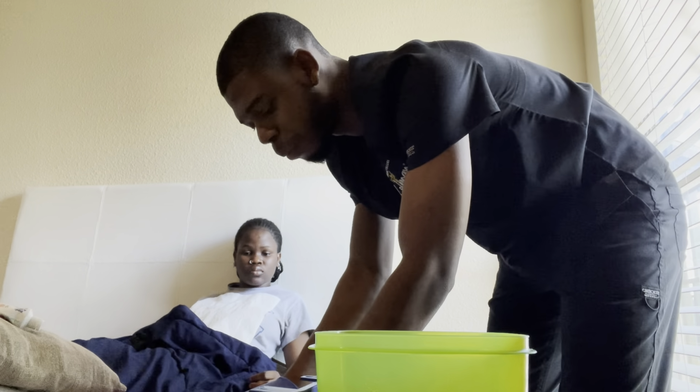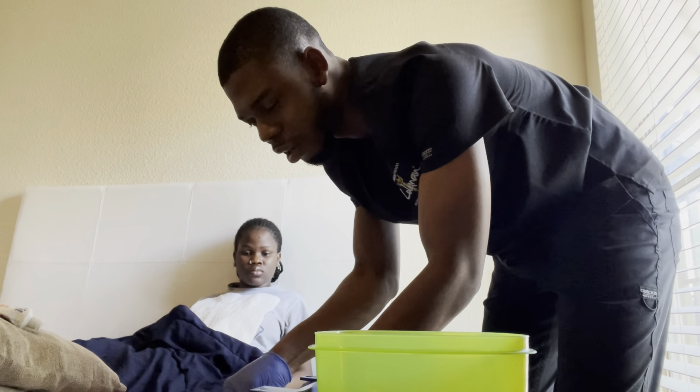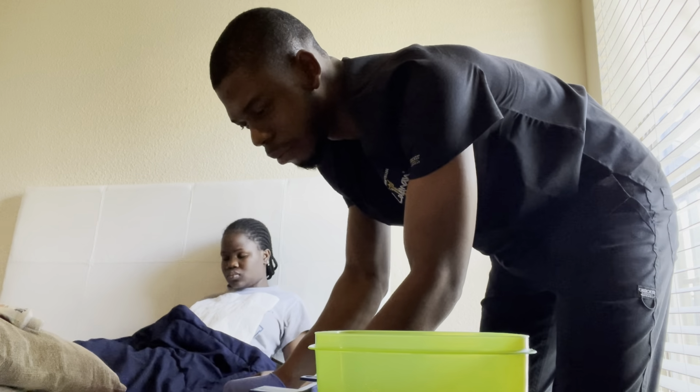And I will place it by the patient's side in order for another nurse to use it, or if there is any chance of suctioning the patient mouth again.